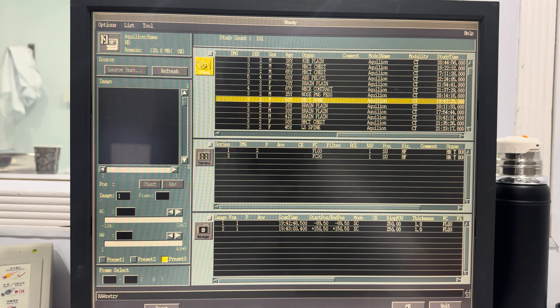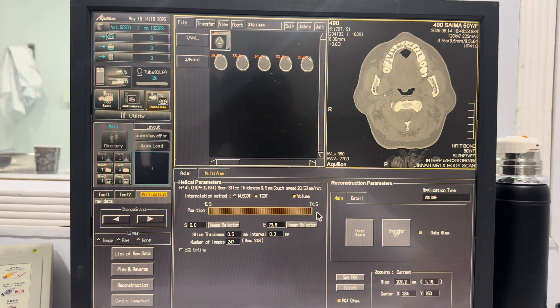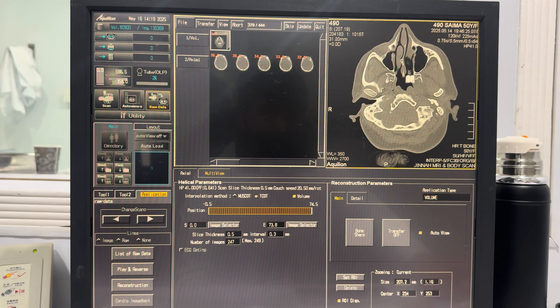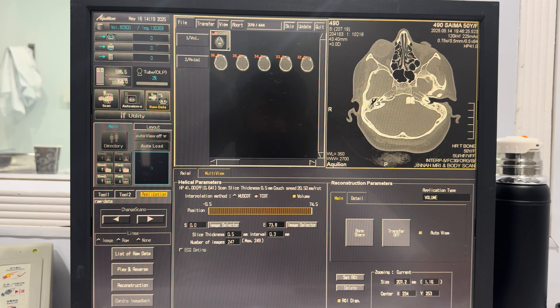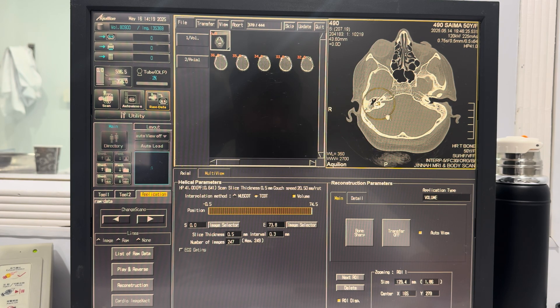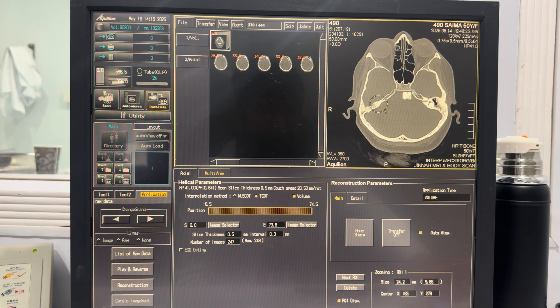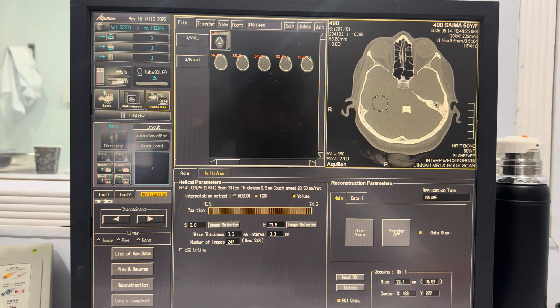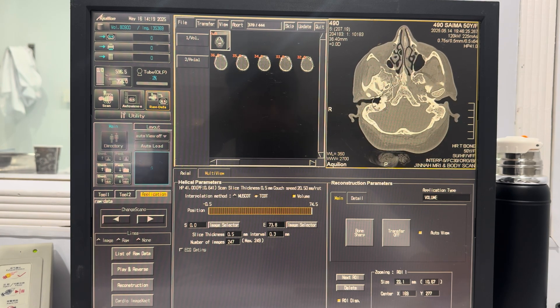You will now see the main interface. Locate and select the volume that has been acquired in the bone window setting. After selecting the appropriate bone window volume, click on the Set ROI button to begin defining your region of interest. Adjust the ROI box so that it precisely encompasses the cochlea and the semicircular canals.